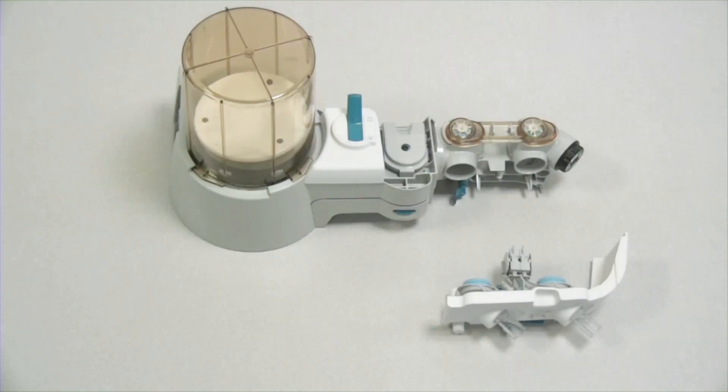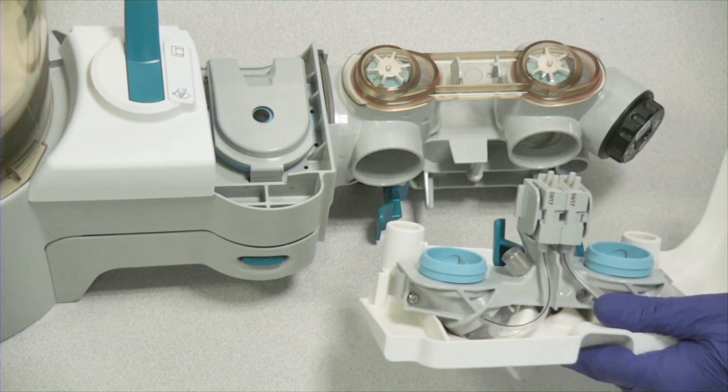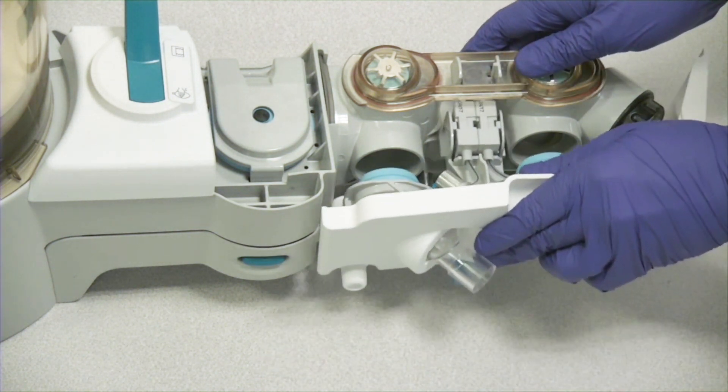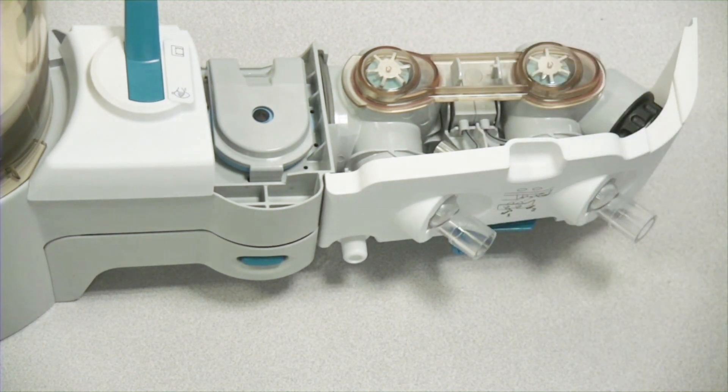Attach the flow sensor module to the breathing system. Align the flow sensor module with the breathing system, slide it into place, and push inward snug. Now your breathing system is fully assembled.